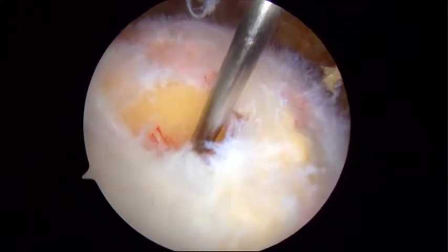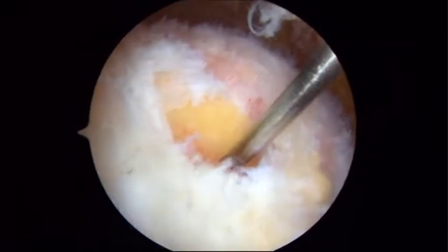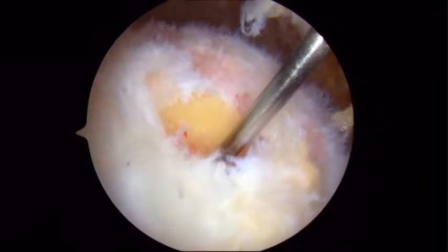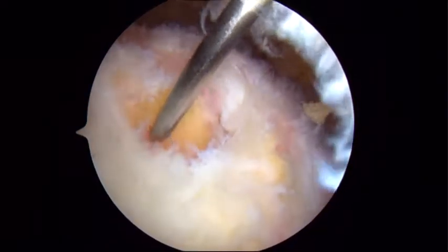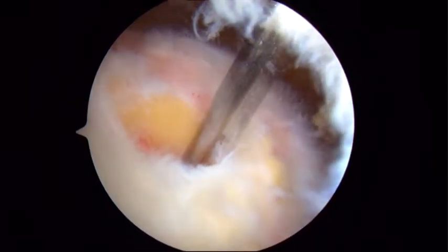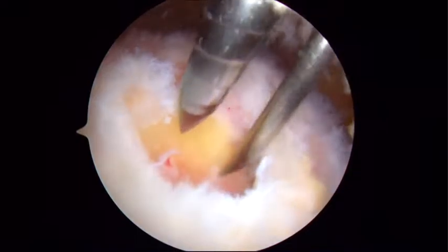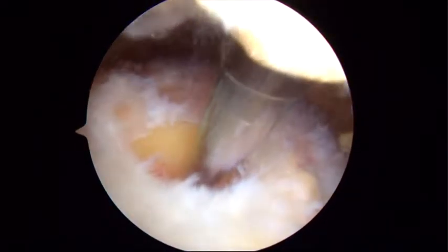Once we're debrided, we'll use a standard lateral paracromial percutaneous portal for our single anchor for a single row. That works well for single row since the anchor is not fully medialized. Needle localization is always best — just follow the needle in with your dilator, and depending on the hardness of the bone, that's how far you'll insert your dilator.